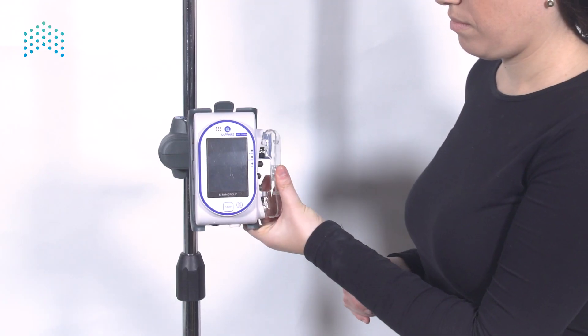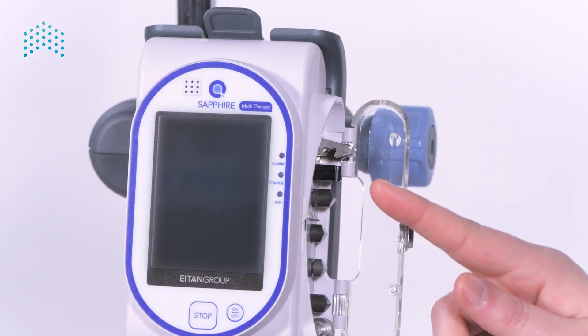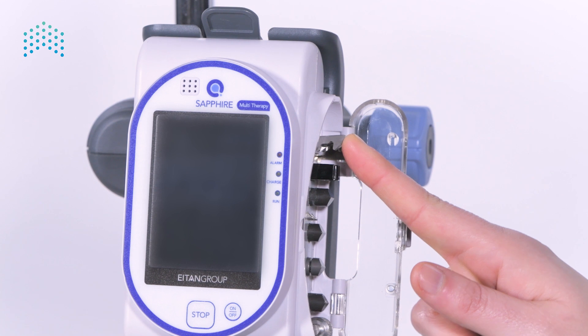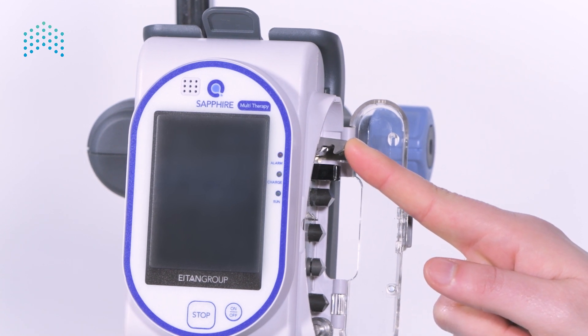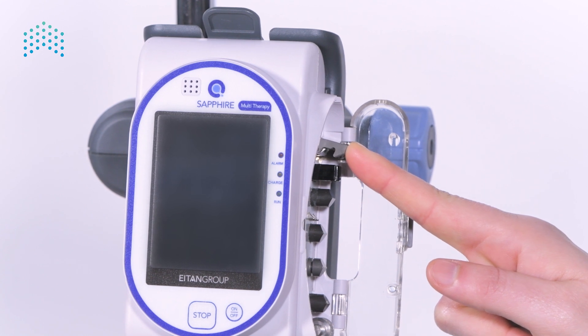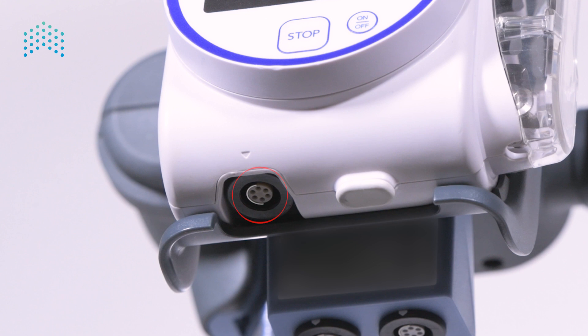On the side of the pump there is a safety door that houses the administration cassette. Note that the door does not include any mechanism and the administration cassette is locked by a lock internal to the pump. This means there is no risk of the cassette getting disconnected during infusion, even if the door is opened. At the bottom of the pump there is a connection where the bolus handle or the power supply will be connected.